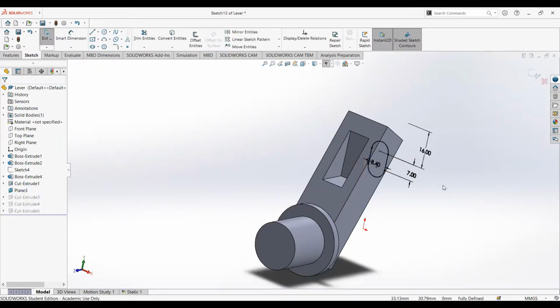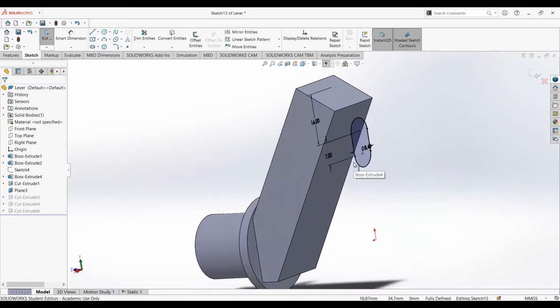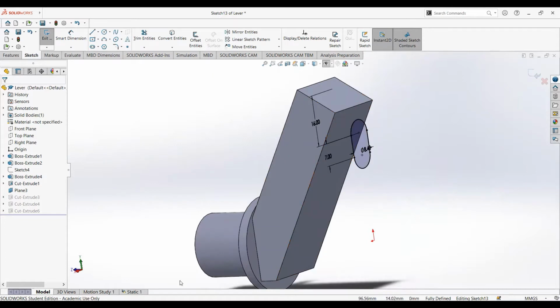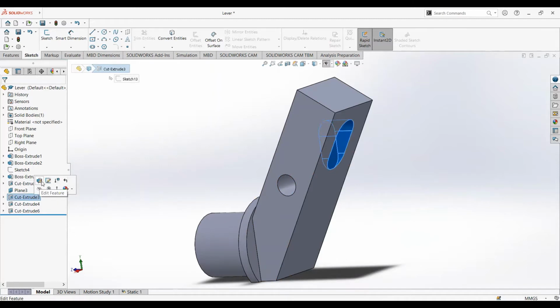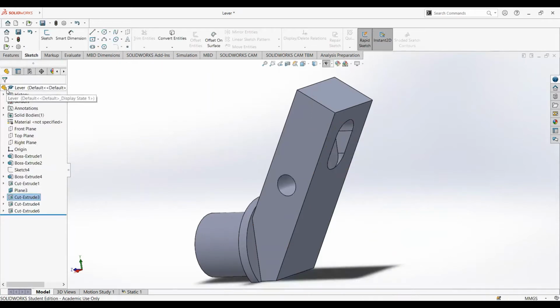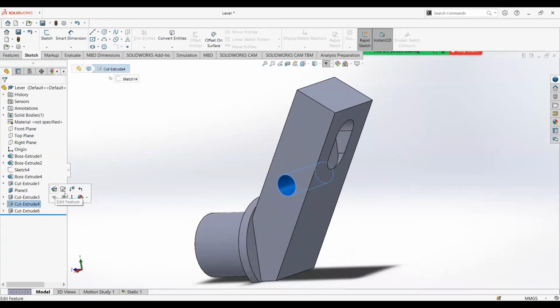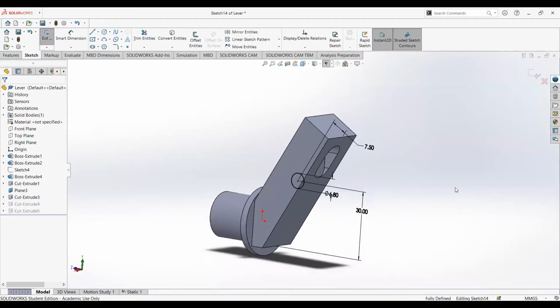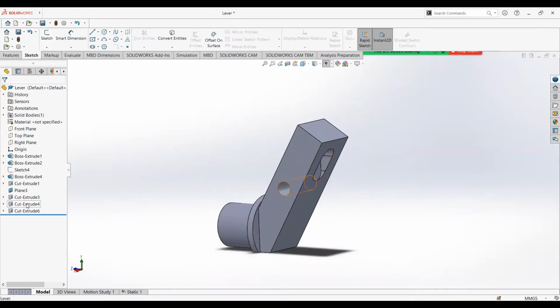Next, we sketched another part right here. And these are our dimensions. We zoom it in here. And we also cut extruded this part, so we can put our knob here, which you'll see on the whole assembly. After that, we sketched a circle here and then we made a hole. We cut extruded that part. So these are the dimensions. And we cut extruded that part.